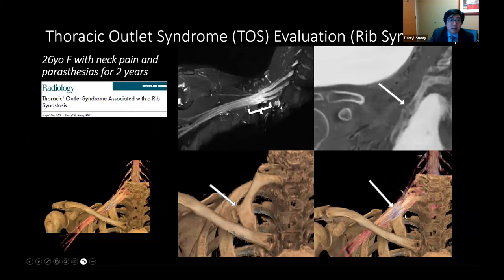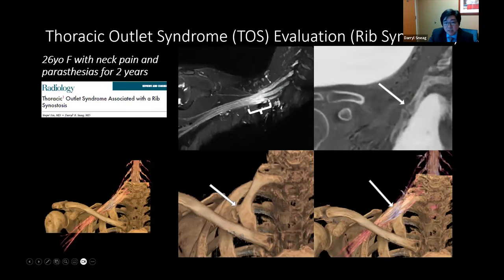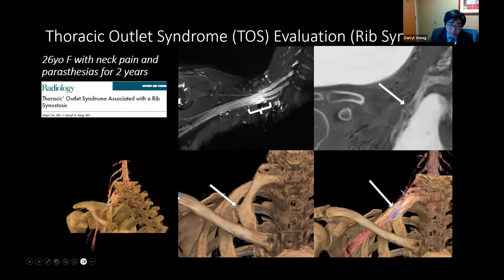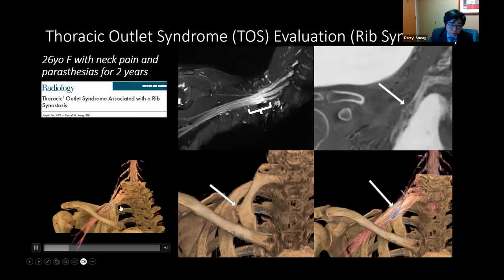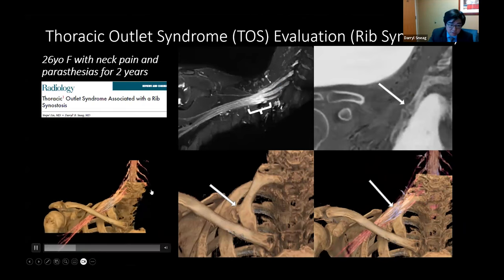A thoracic outlet syndrome example with rib synostosis: a 16-year-old female with neck pain and paresthesias for two years. On MRN, there is hyperintensity in the brachial plexus. We also observe the rib synostosis from bone MRI, then render both together to visualize the area of brachial plexus hyperintensity against the rib synostosis in 3D.